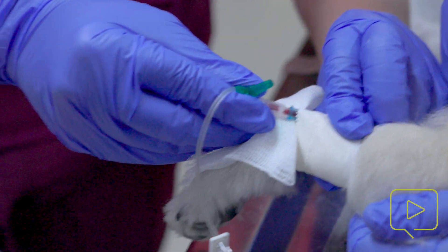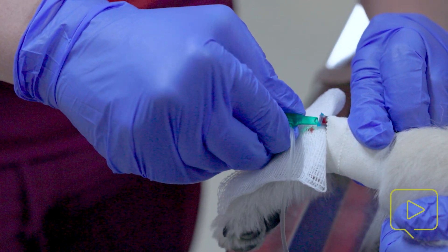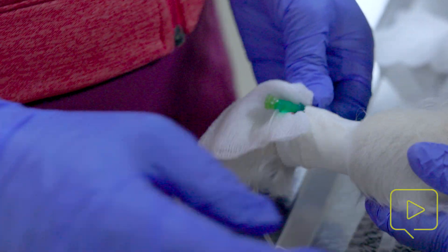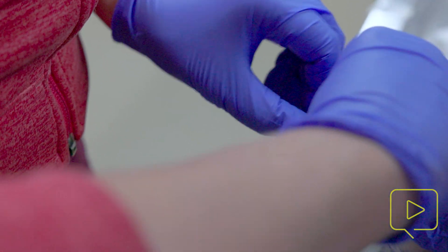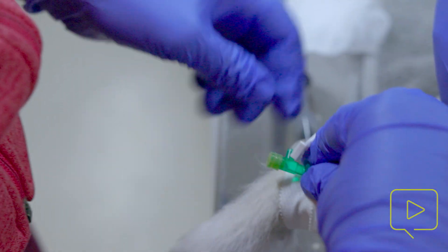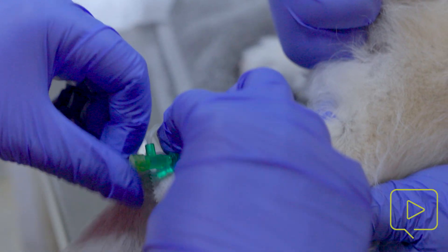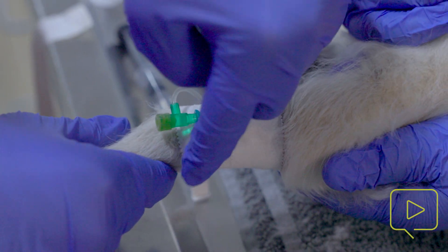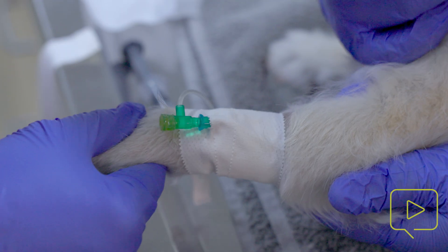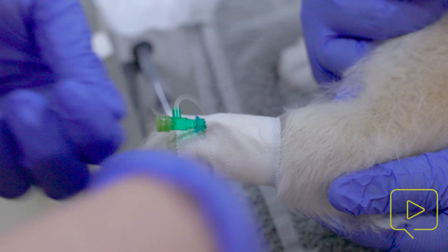I'm going to hold off the vessel the best I can, pull off this adapter, and then put the T port on. You can have the T port facing either way. I personally like to have it facing the inside — hold it tight, twist to adjust if needed, and make sure it's on firm so it doesn't leak out between the connections. I like to have it this way so I can horseshoe the other side out to the outside, which gives easier access especially if you have a dog that's fractious and likes to bite — you can come from the side instead of reaching right under their face.